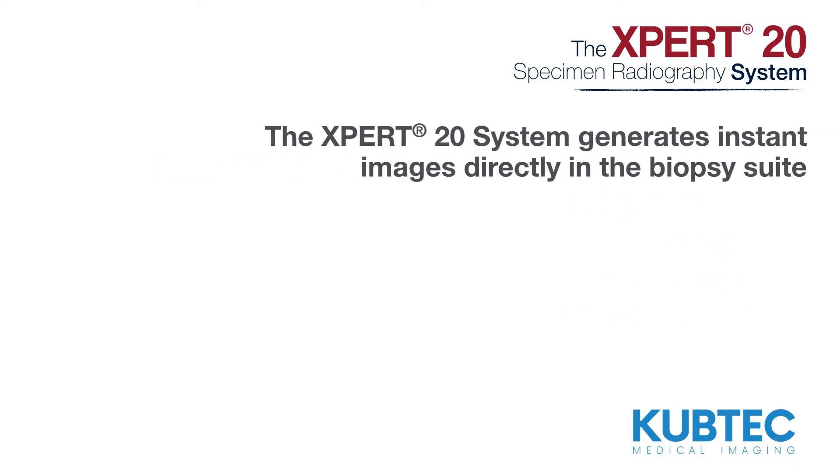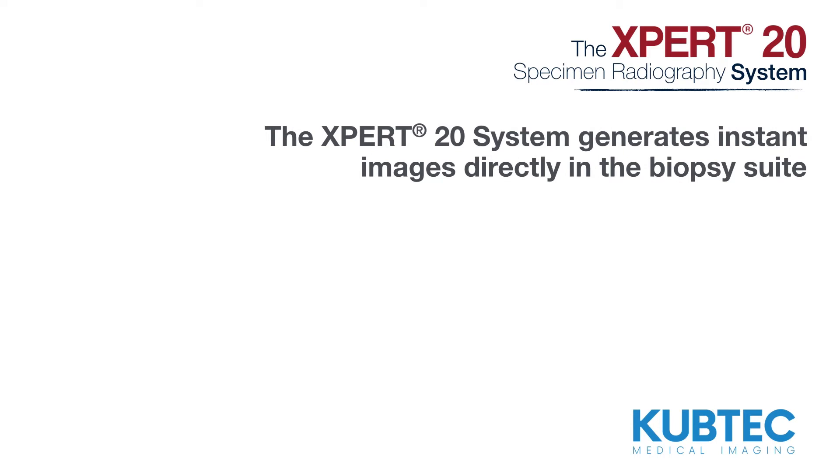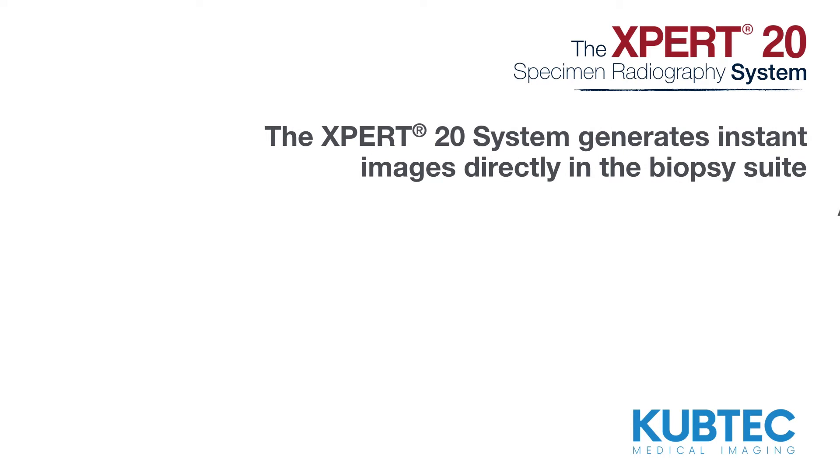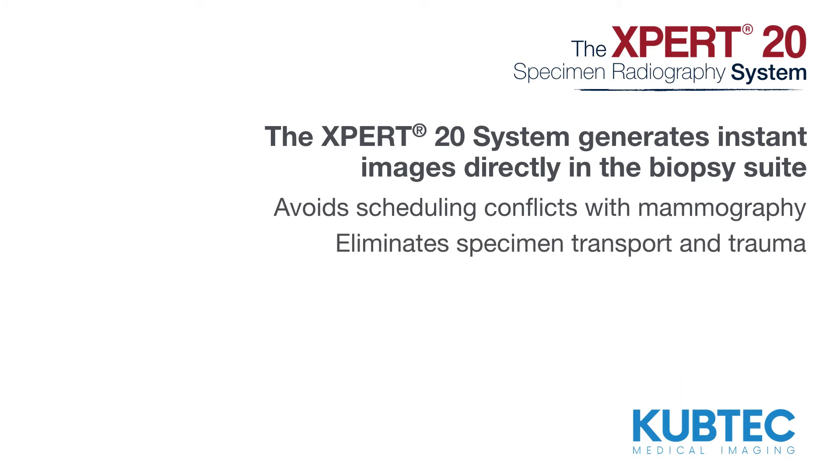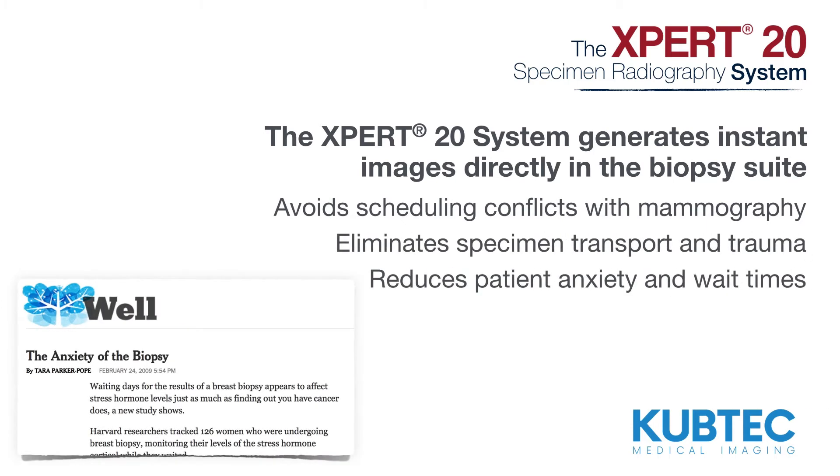The Expert20 system generates instant images directly in the biopsy suite, avoids scheduling conflicts with mammography, eliminates specimen transport and trauma, and reduces patient anxiety and wait times.